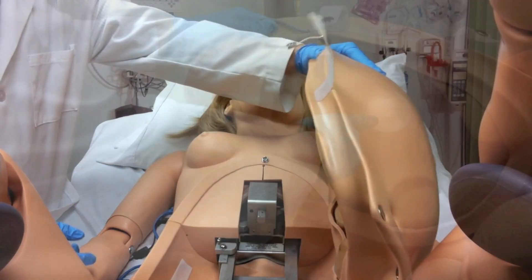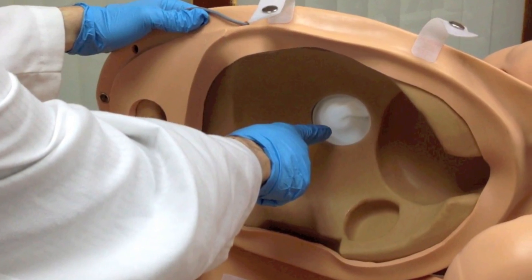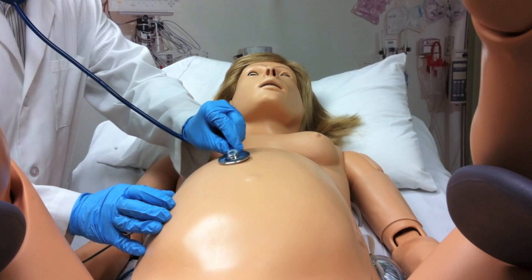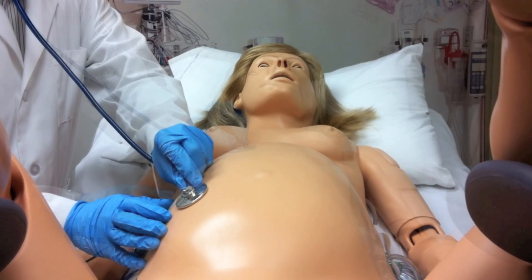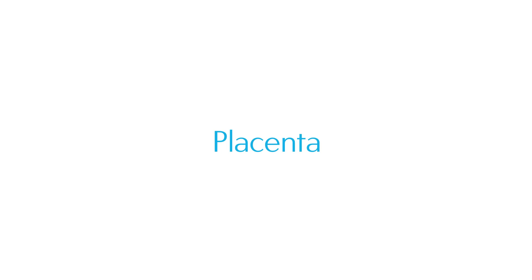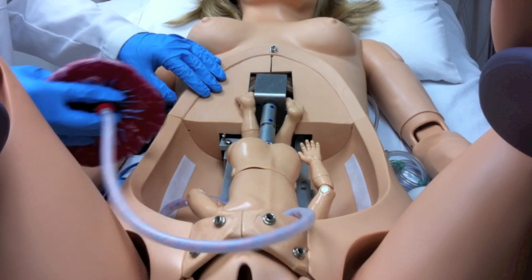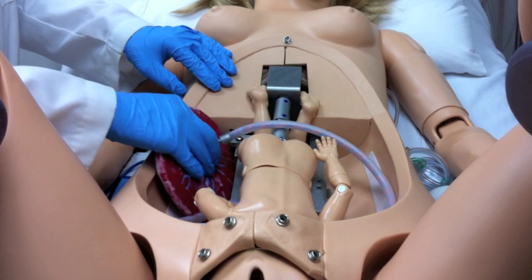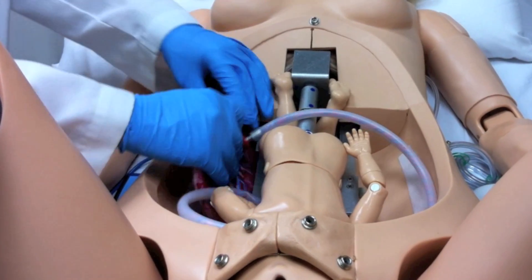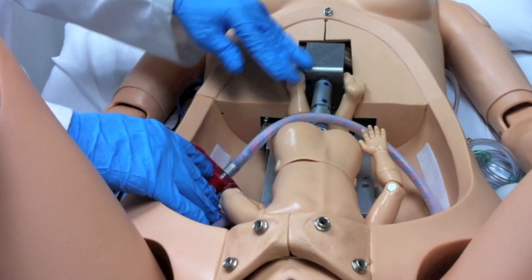NOEL's tummy cover includes speakers that play fetal heart sounds that can be heard with a stethoscope. NOEL also comes with a placenta that can be placed in the upper or lower abdomen. Similarly, you can place the placenta so a fair amount of traction is needed during the delivery.